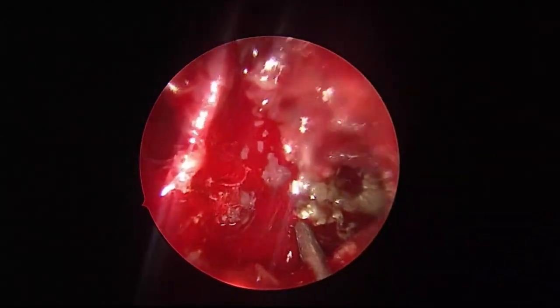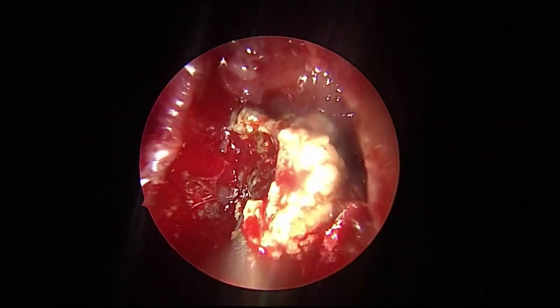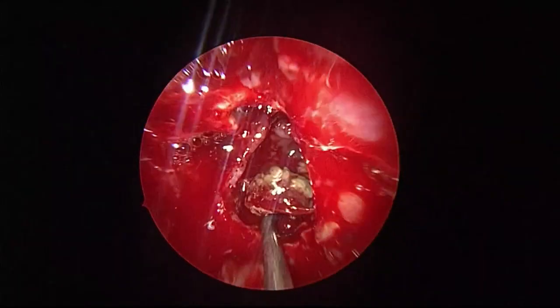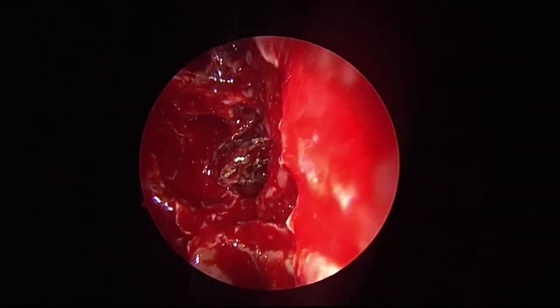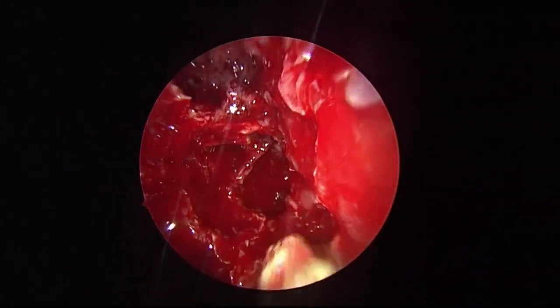Are you working on the other side? On the left side? Not really. We'll show you the intersinus septum, how it is pushed. See how much the sphenoid is expanded and fungus coming. Another big one.